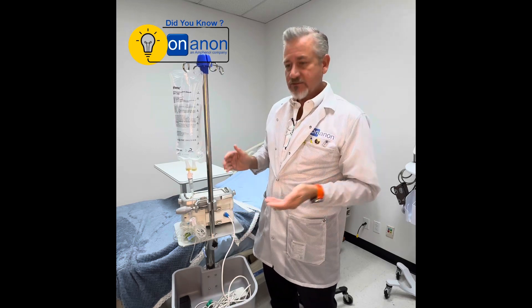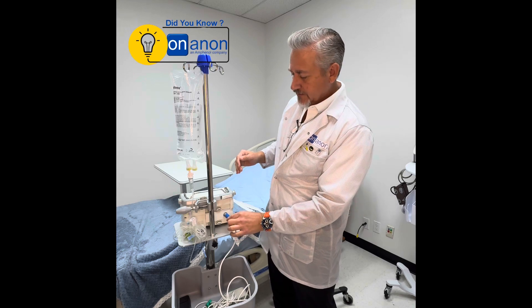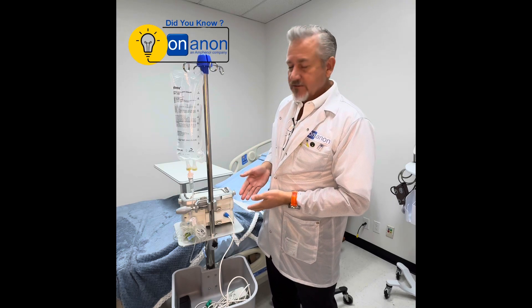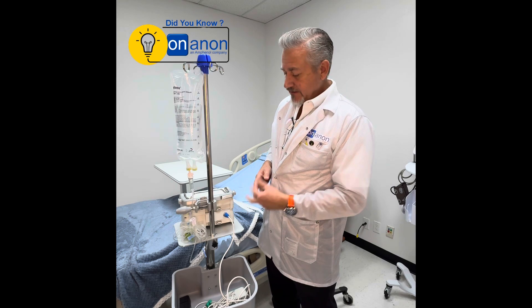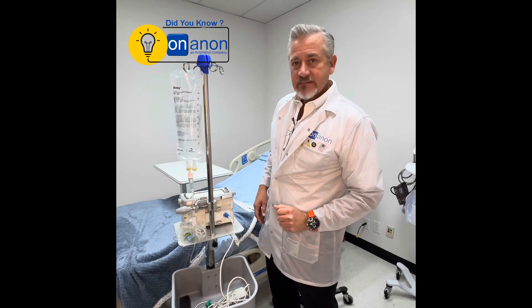MagConnect is the most intuitive connector in the world. You simply pull to unplug, and get it close to the connector and it plugs itself in. It's very inexpensive. It's used in disposable applications and reusable applications, and ideal for something that a patient needs to interact with.